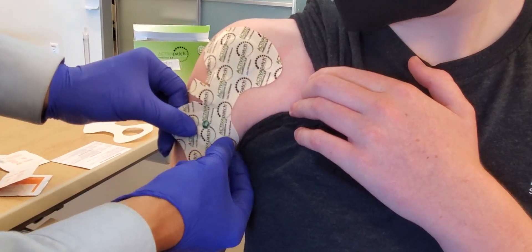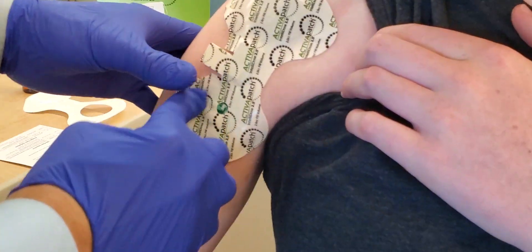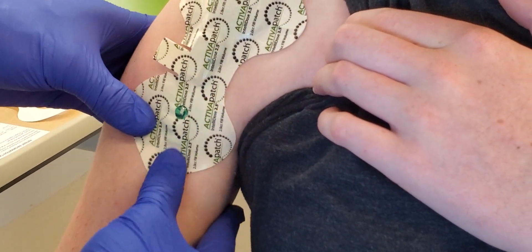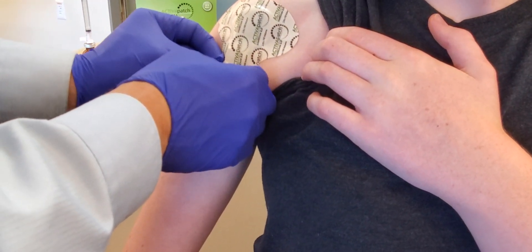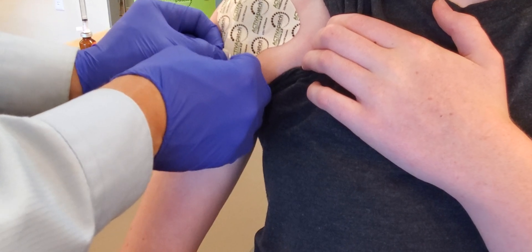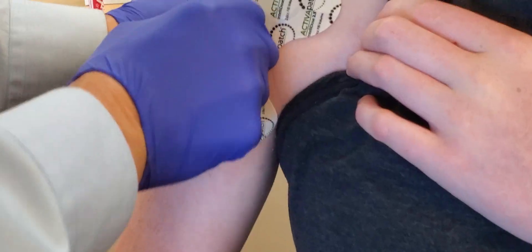We're going to come around the pad without actually pushing on it so that we're not leeching out the medication. Go ahead and just open up your arm a little bit. The patch is creating an electrical current that will cause the medication to be administered to the superficial tissue of the biceps tendon. Then we just take off the little tab, just like this.